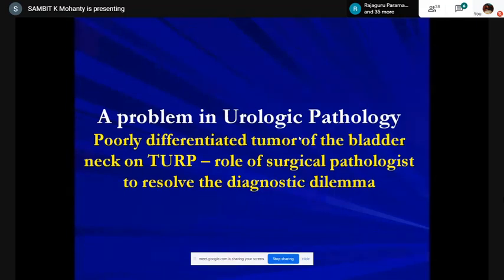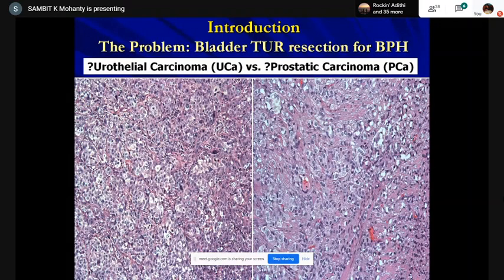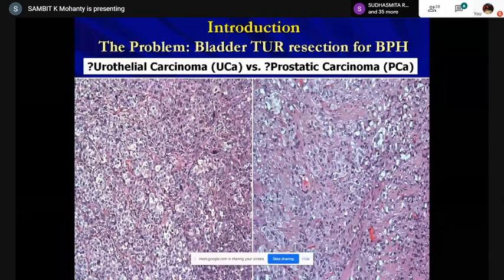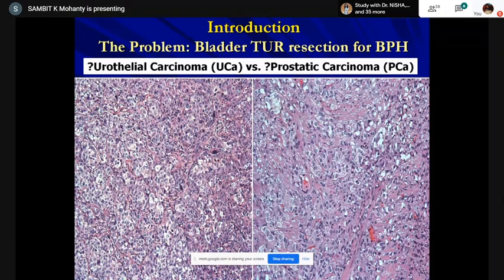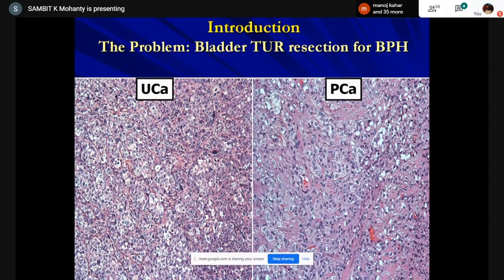Here we have two cases. The right one has more clear cytoplasm, a nesting pattern with inflammatory stroma, some signet-ring cells, and muscle involvement — the bladder neck muscle is involved in this high-grade carcinoma. The left one has nesting or vague urothelial nest appearance. We do not know which is bladder and which is prostate just from morphology. After workup, the left turned out to be bladder and the right turned out to be prostate.